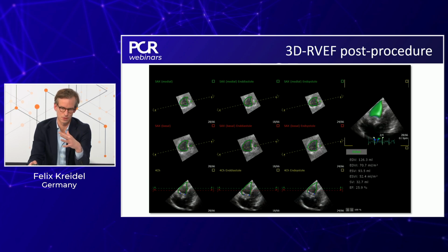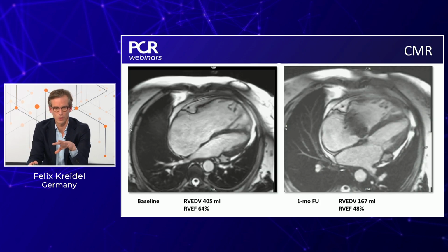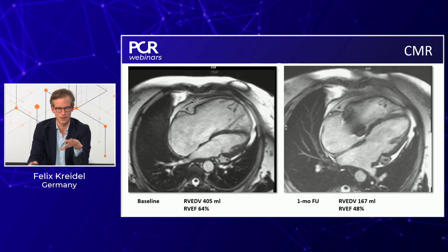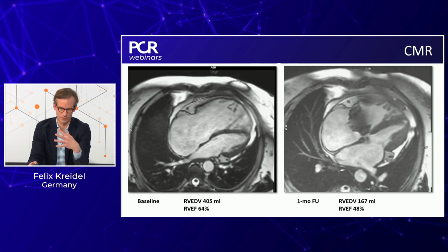Interesting, reduction, EF is here calculated to be around 25 to 30%. That seems to be very low. Interesting discussion point, obviously, why is this? But after 4 weeks, we had this patient for a follow-up MRI. This is not what we do in every patient. Here we had the chance to do it, and this proves just in a massive reverse remodeling.